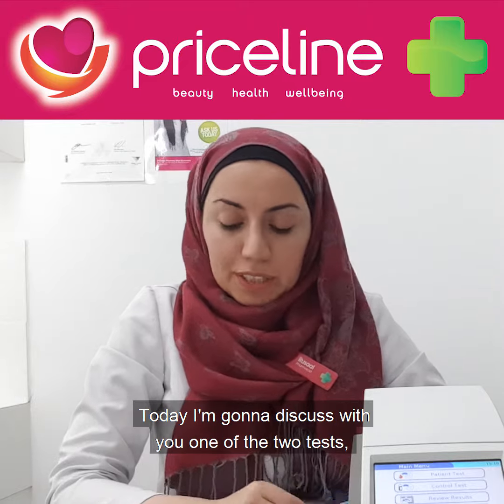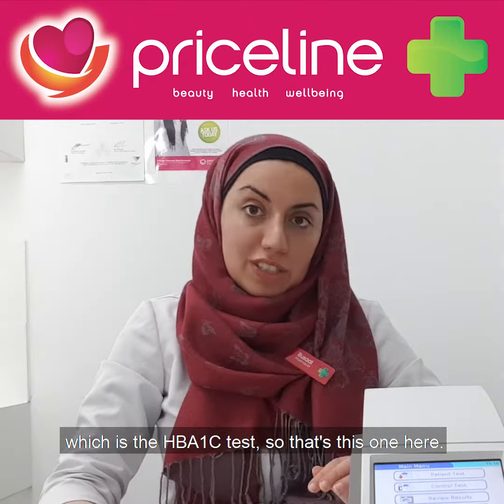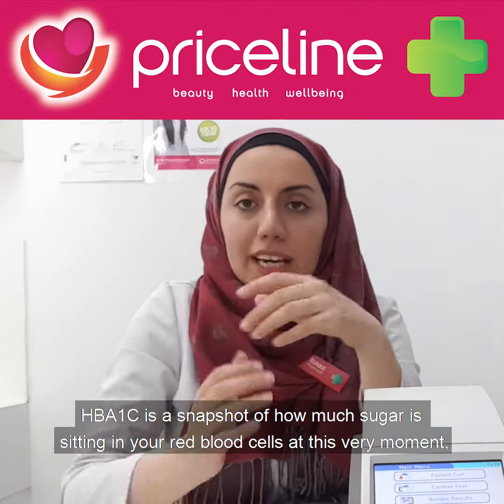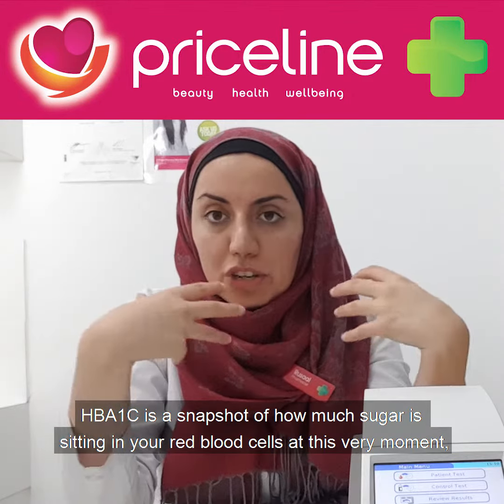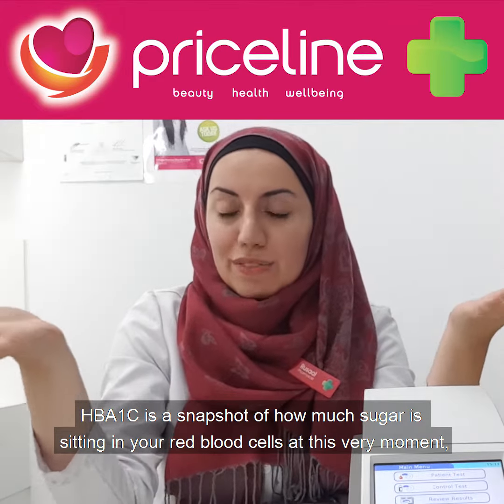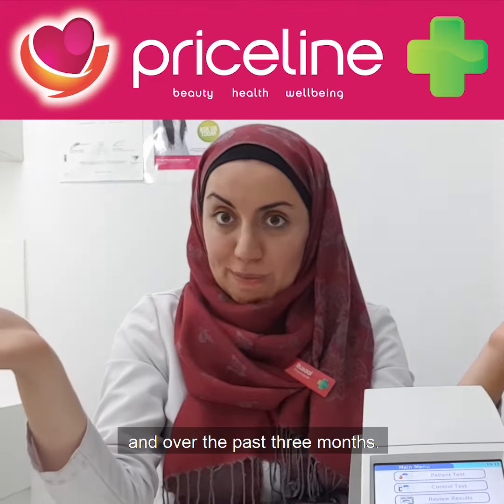So today I'm going to discuss with you one of the two tests, which is the HbA1c test. So that's this one here. HbA1c is a snapshot of how much sugar is sitting in your red blood cells at this very moment and over the past 3 months.